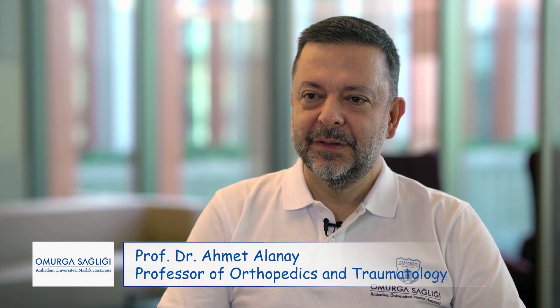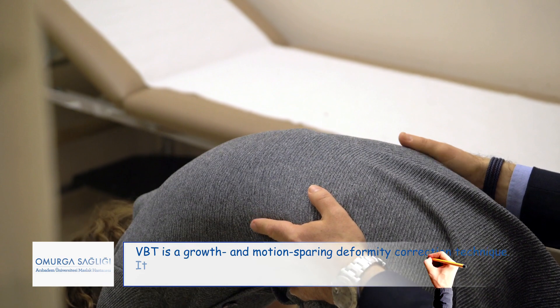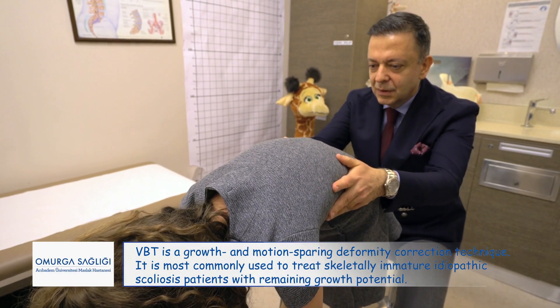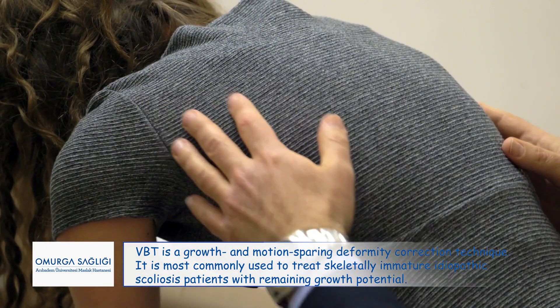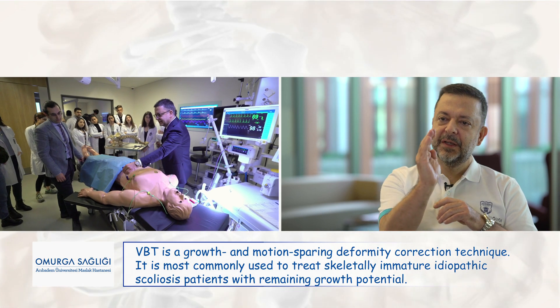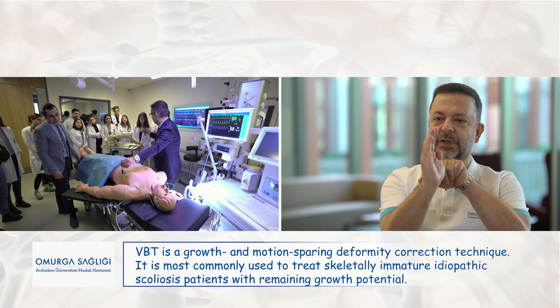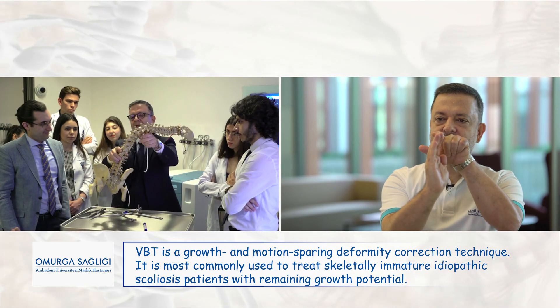Vertebral body tethering is a relatively new treatment for scoliosis. Its most important characteristic is that it preserves the mobility of the spine while allowing spinal growth. It is a minimally invasive technique — the incisions are smaller and there is less blood loss compared to open methods. If scoliosis is simplified as a growth disorder in which the spine is growing in the wrong direction, VBT harnesses and redirects the spine to the right direction.